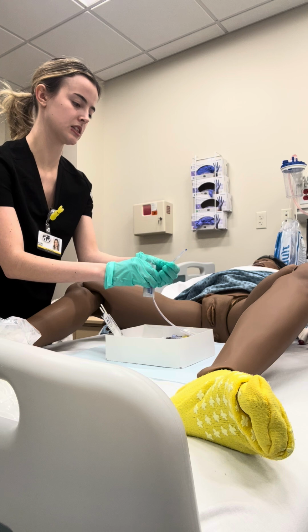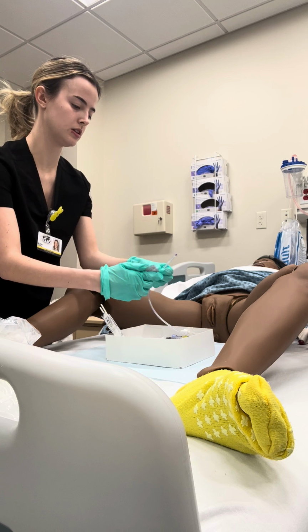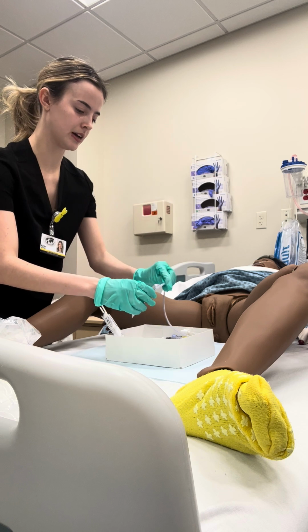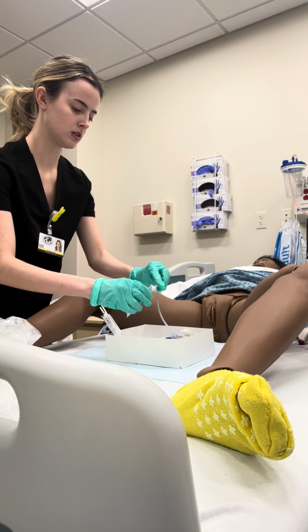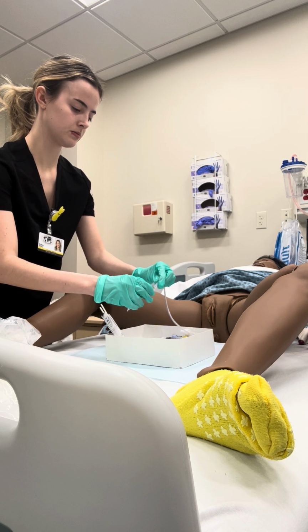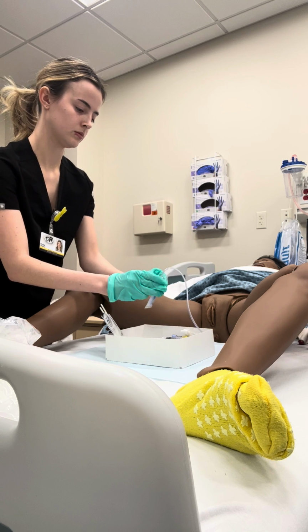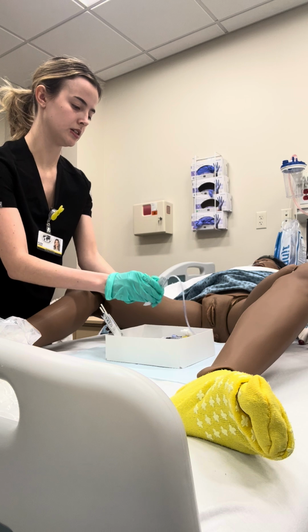I'm using the smallest size possible. This is a 12 French catheter. And I'm going to go ahead and lubricate. And then try to loosen that so it's easy to get out.